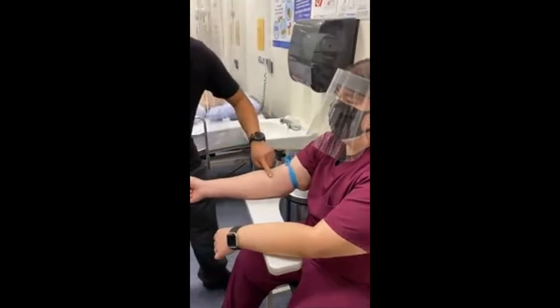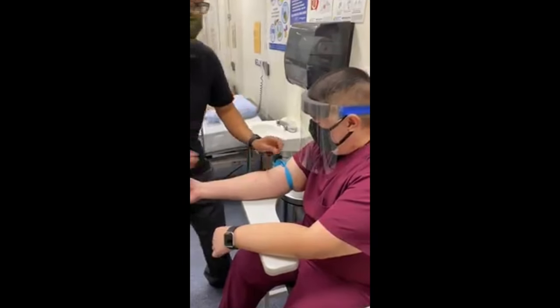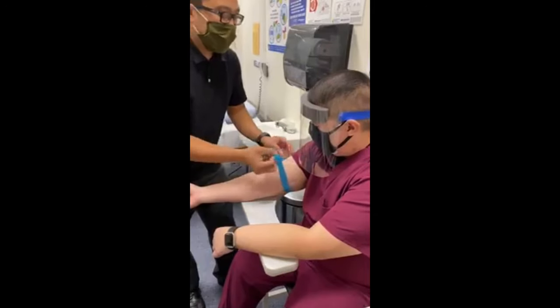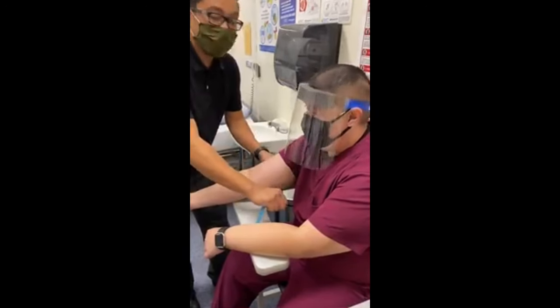Do you think I'm gonna feel something? Nope. All right, it's gonna make my job harder. So as long as the patient doesn't have loose skin, you can make it tight enough for them.